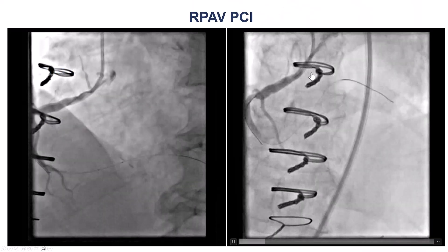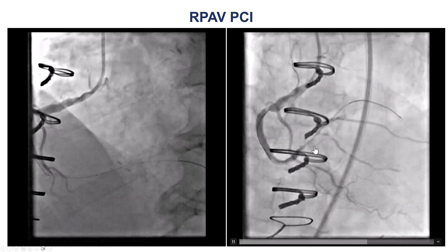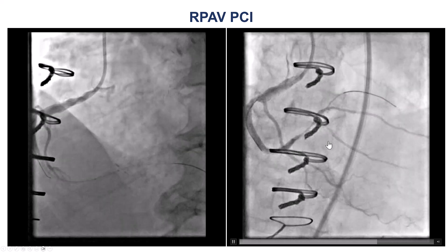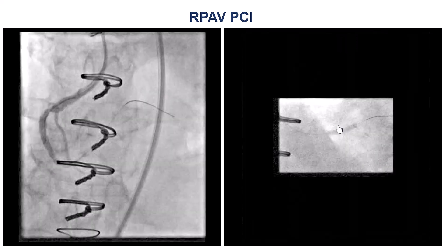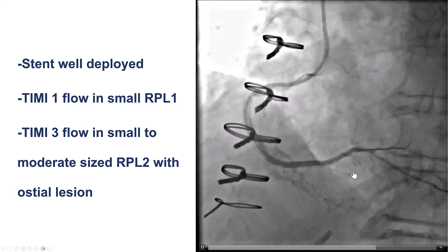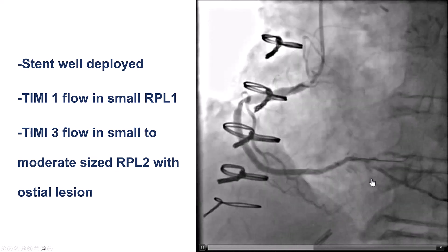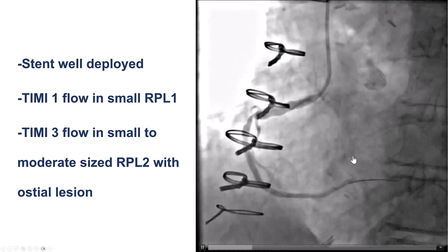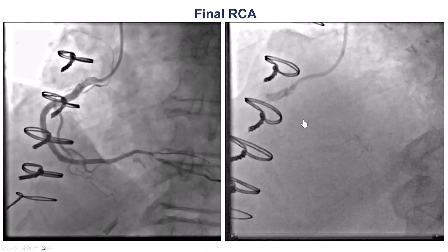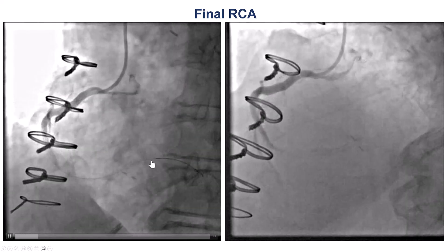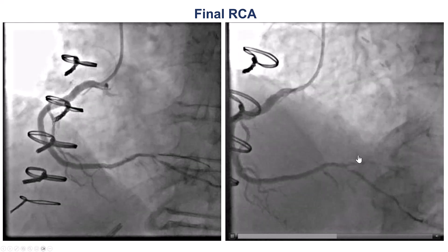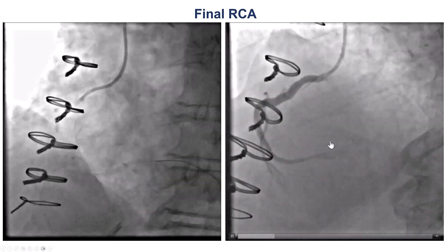There you go. We performed balloon angioplasty, and this was very encouraging because now we saw the vessel was actually much larger than we thought before. So we were happily surprised that yes, this is the culprit for the patient's presentation. Unfortunately, after we put in a stent, we had essentially occlusion of the first posterolateral. There was also some diffuse disease on the more lateral posterolateral. We did some balloon inflation and also stented at the proximal right coronary artery, but then decided not to place additional stents. The concern was about compressing this further and obstructing flow. We could have treated the posterolateral, but after multiple hours we decided to just let it go — there was a risk of losing this branch — and bring the patient back for a staged procedure.